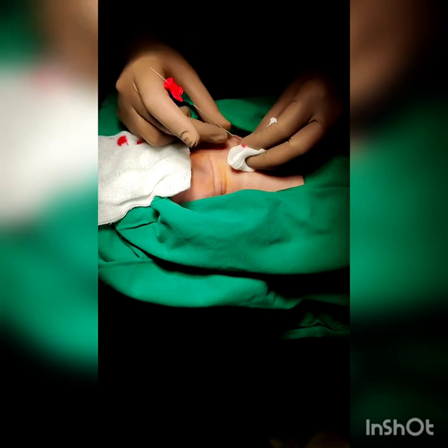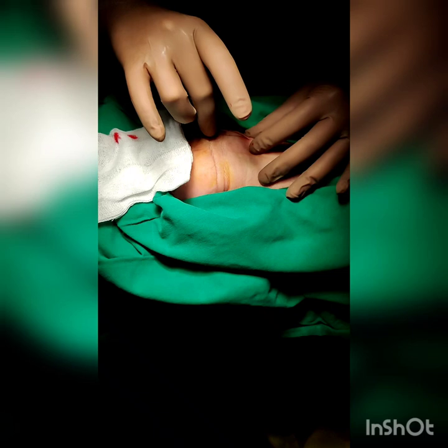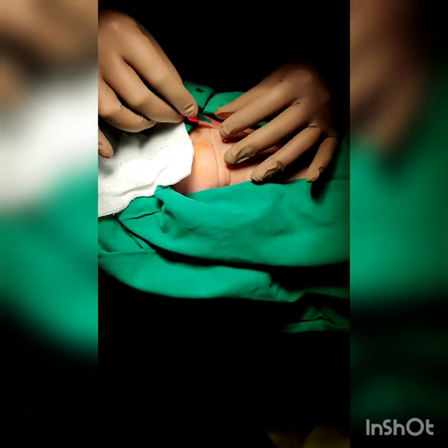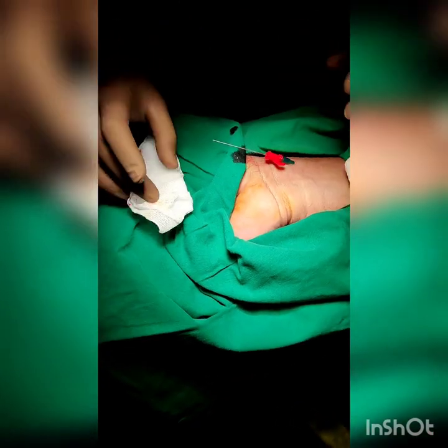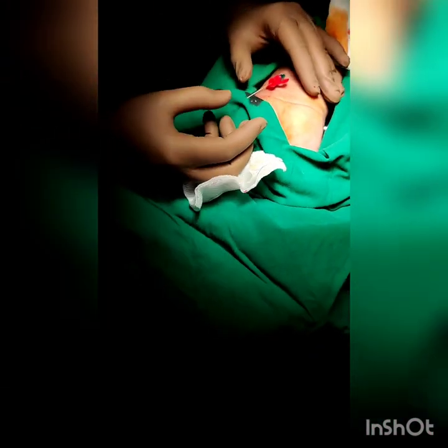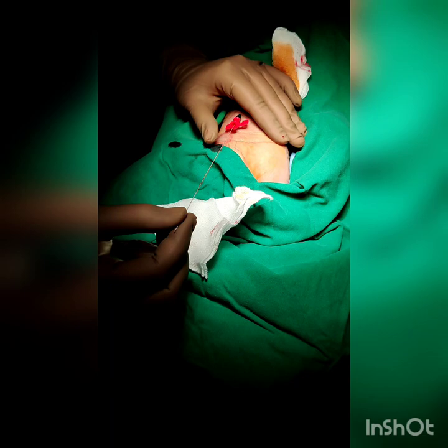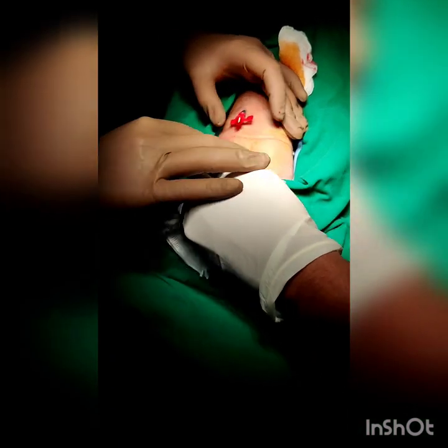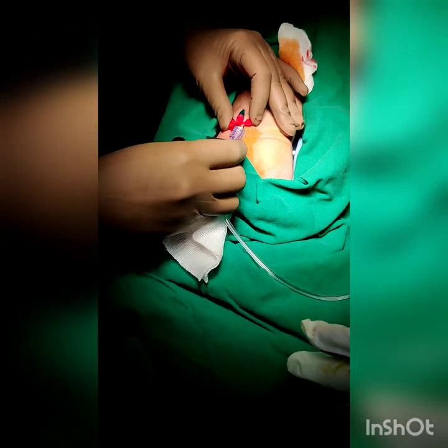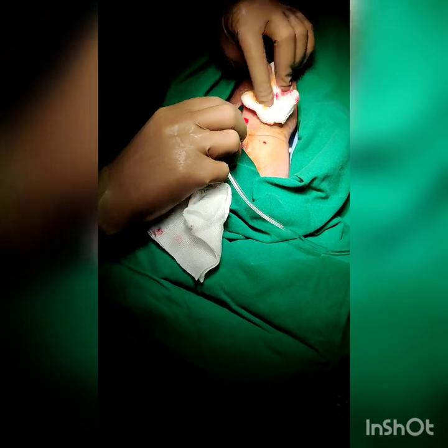The entire length of the arterial catheter is introduced into the arterial lumen, and the guide wire is removed. Pulsatile flow of blood from the radial artery is confirmed. The saline flush tubing from the transducer set is then attached to the arterial catheter and screwed well to prevent any leaks.